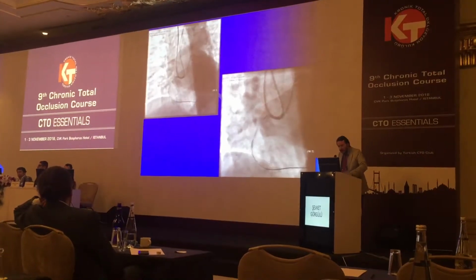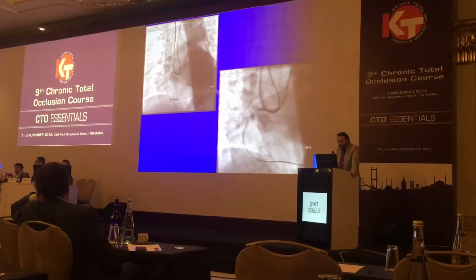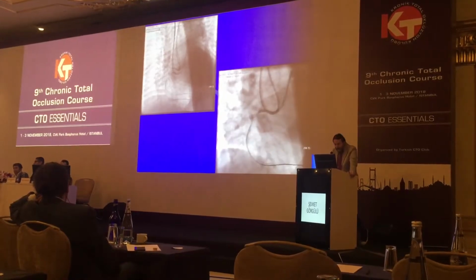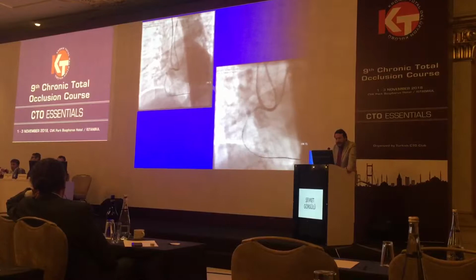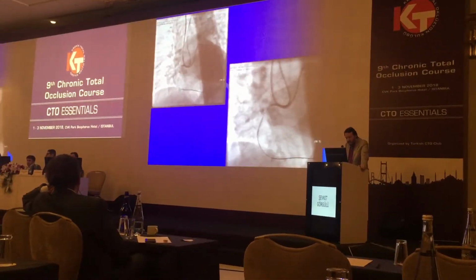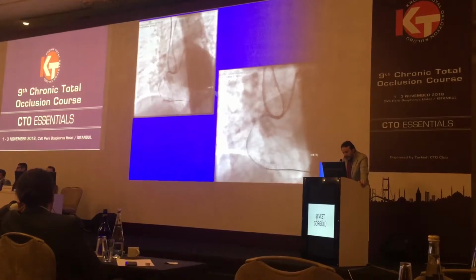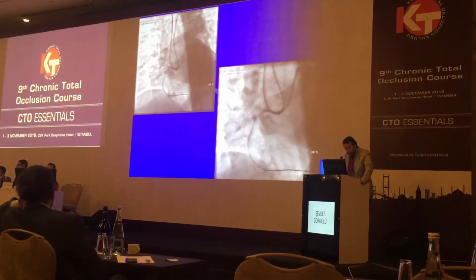As soon as the left Amplatz 2 catheter entered the RCA, it created a large dissection until the crux, involving also the proximal part of the aorta. One can easily see the dissection line. The bright side of this dissection was that antegrade passage with the Corsair was possible. In such a case, one should strictly abstain from giving contrast antegradely to prevent any catastrophic complications.